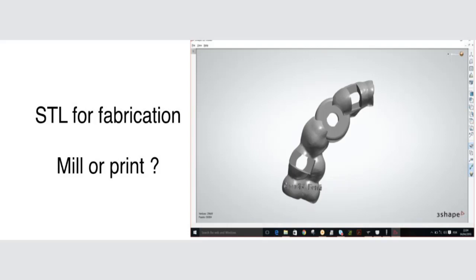Some people could ask, Nelson, don't you think that the guide with several windows would be fragile and could not work properly? Well, it depends how you design it. I will show here another option that one could have on guides that use what's called tubular design, and I don't see any fragile aspect of it. So it depends on how you design. As many windows as possible, as long as the guide is not really thin and it's not really flexible, then you could be okay to go.